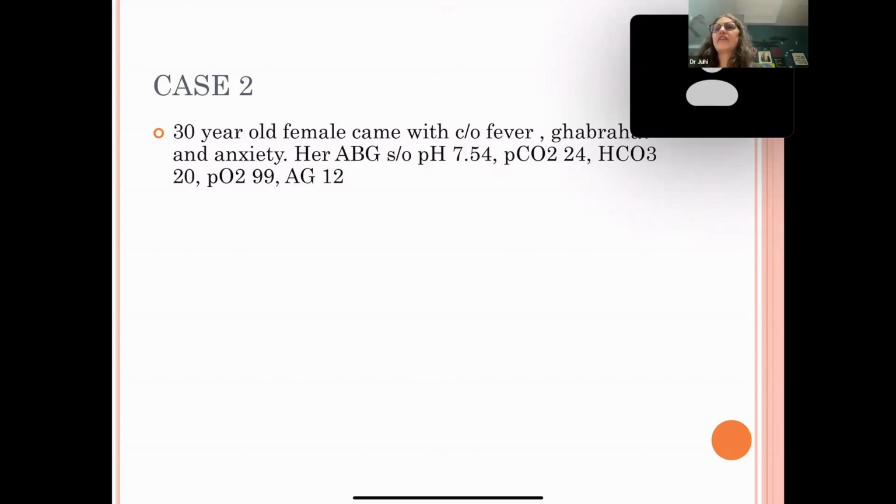We've checked the validity. And what was the formula for it? PCO2 by bicarbonate into 24. Very good. It should be the hydrogen ion concentration. Right. Okay, supposedly your ABG is valid.